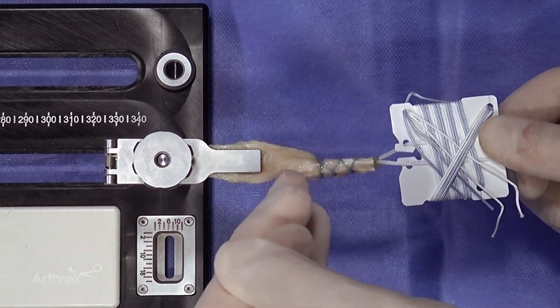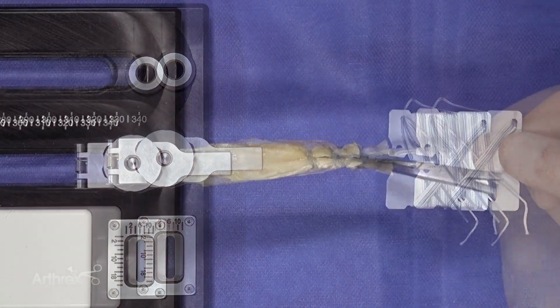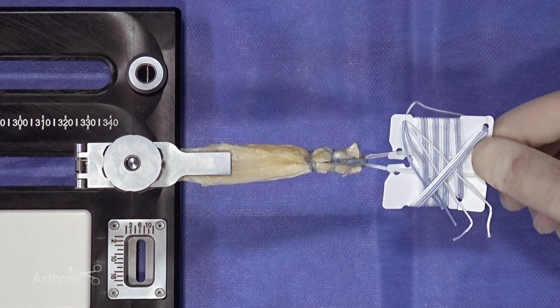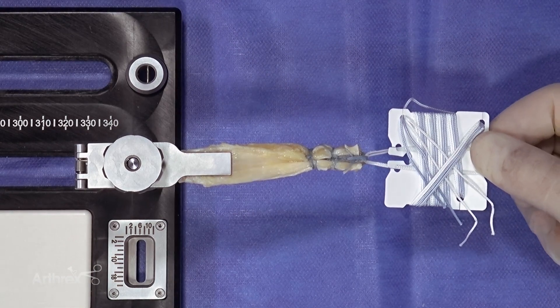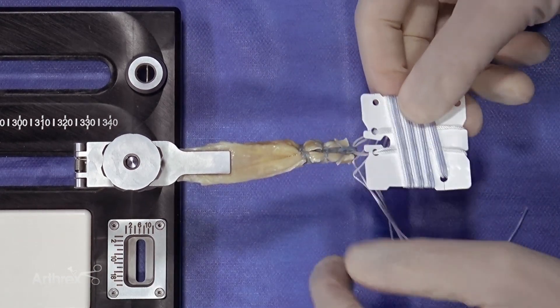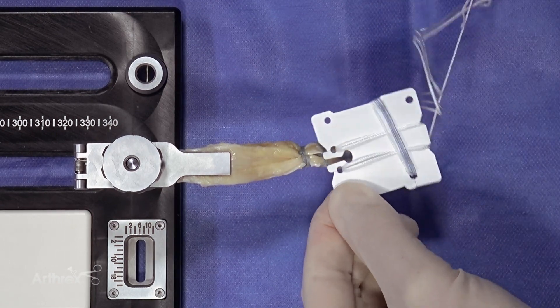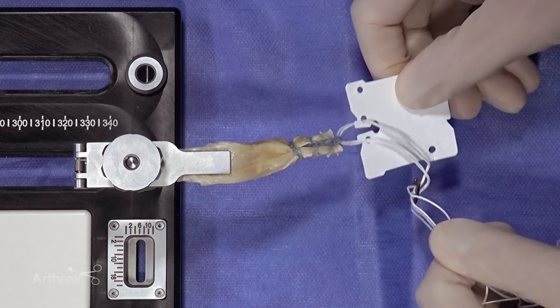We then go to the other side and cut it. The nice thing about this is we can take the very proximal end of the graft and trim it. You don't want to get your graft stuck at the aperture of the tunnel when you're pulling it in. This will allow us to get the whole graft well seated in the tunnel, and this process is not only stronger than any construct we previously described, but it's a much faster technique.